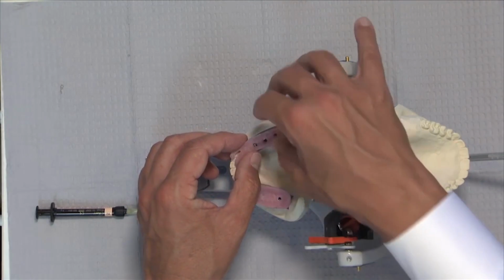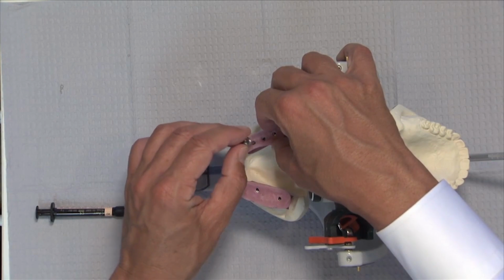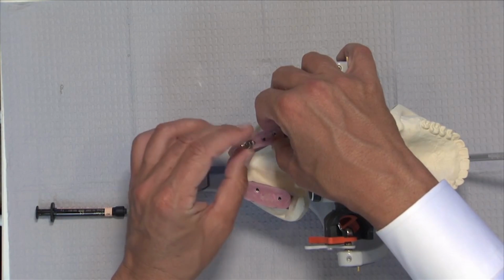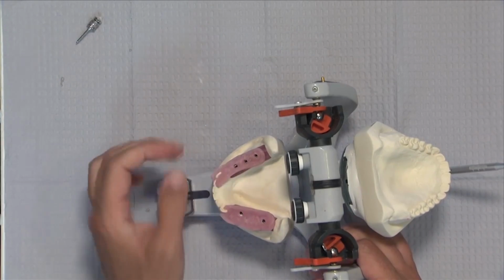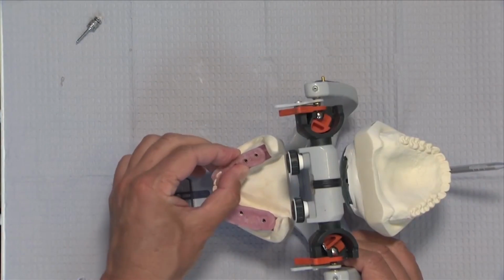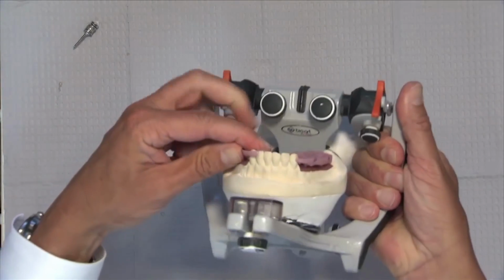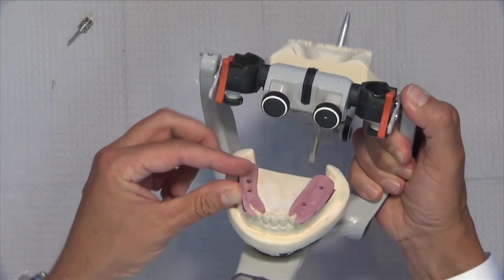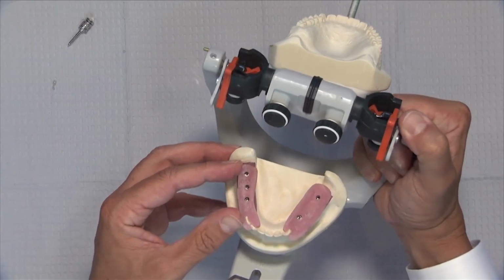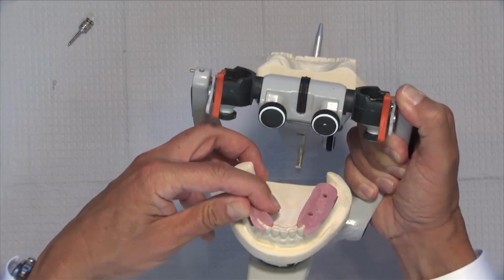And now we'll go ahead and place the guide on the other side with the custom abutments in place, and then begin to tighten those screws down. And now we have the other side tightened down as well. In fact, you can see as I try to rock this that there's really just no movement at all. It's sitting down on top of the custom abutments, and it's also grasping onto the adjacent natural teeth, and it just won't move at all.